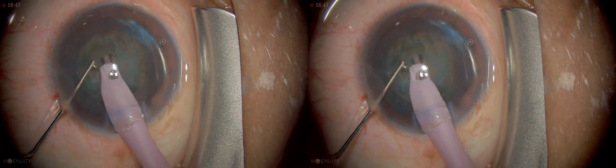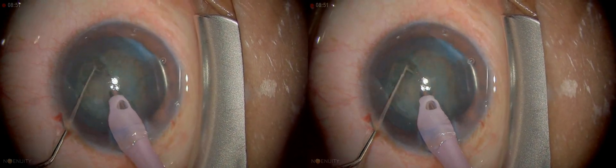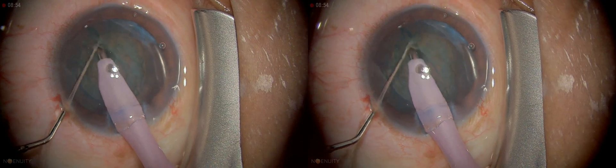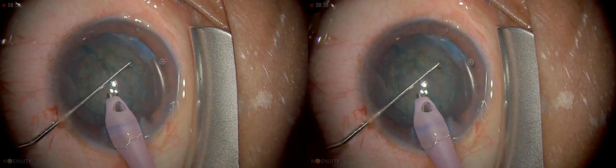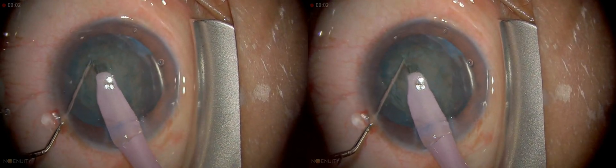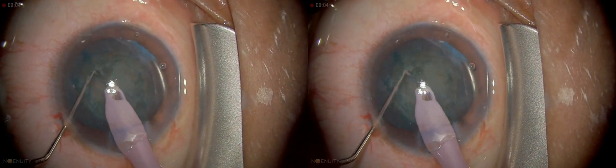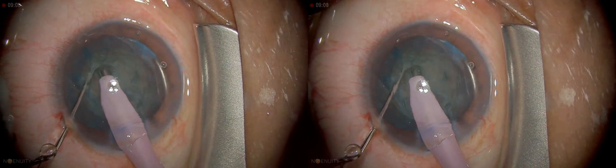This is a fairly soft cataract. It is possible to crack this nucleus, so I'm going to crack it into two. I can see the posterior capsule now.